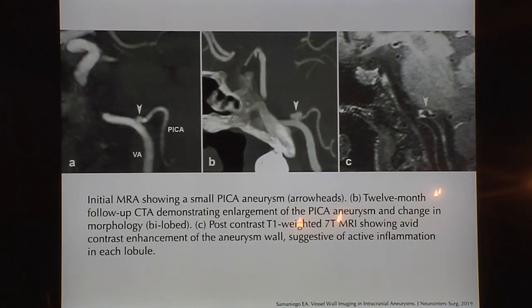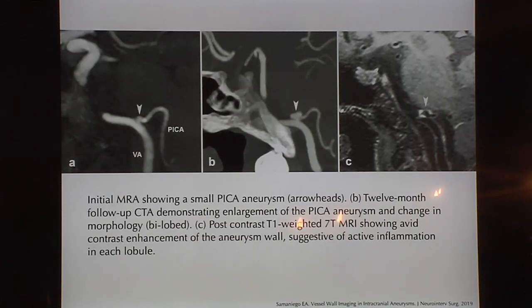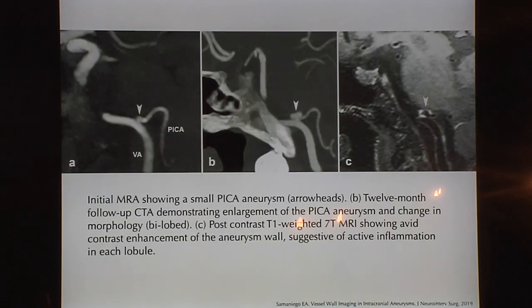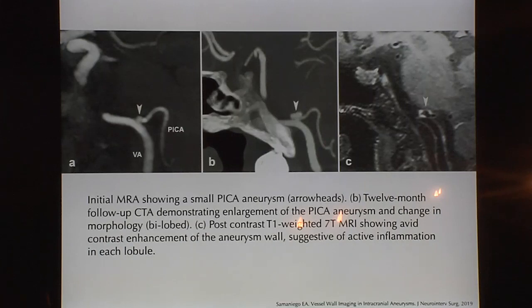Many people say they won't treat a 3-millimeter aneurysm, but there are outliers of small aneurysms that start changing. This is an interesting case of a patient who came to our clinic after a stroke. On MRI we found a small bleb at the PICA. On follow-up CTA the bleb had changed into an aneurysm. We did 7-Tesla MRI imaging and noted the increasing enhancement of the aneurysm wall — something is clearly triggering an inflammatory response causing the aneurysm to grow and change.